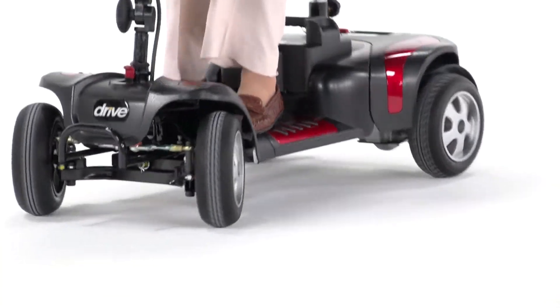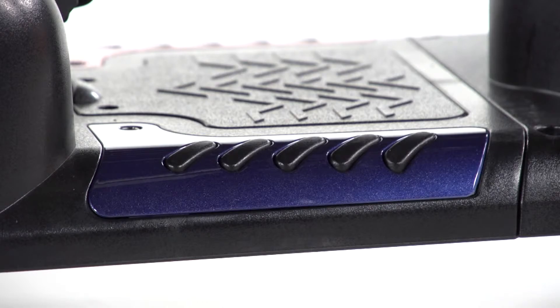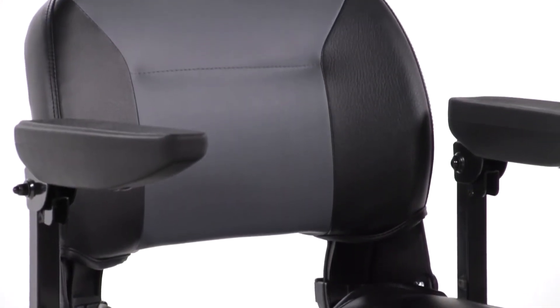The Phoenix HD 4-wheel is not only safe, it's stylish with interchangeable panels in red and blue, allowing you to customize for your style, and attractive two-tone seat upholstery.